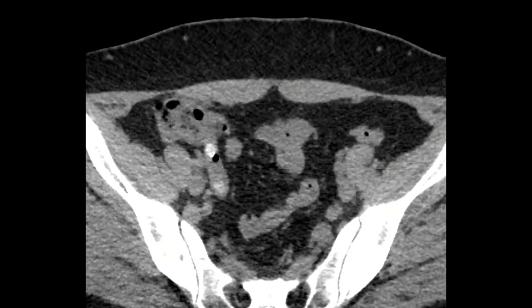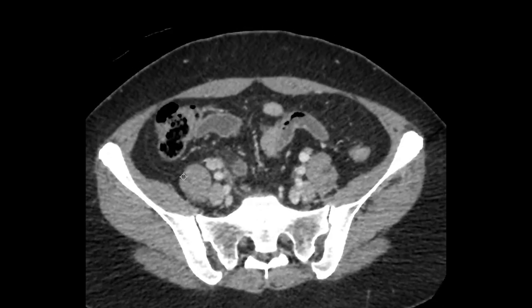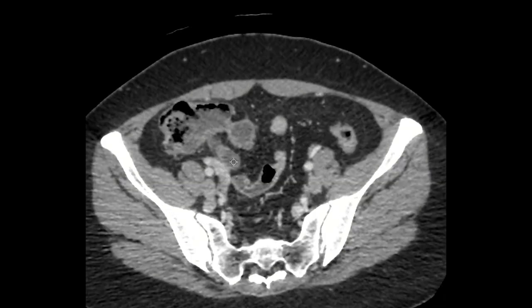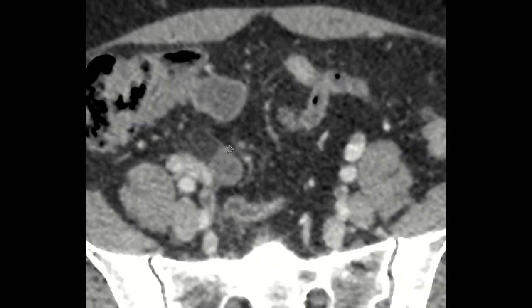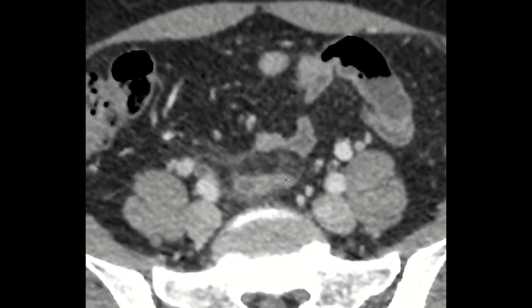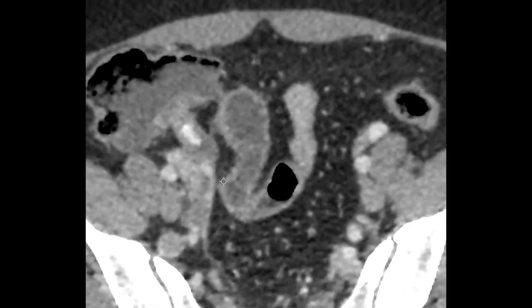And so this patient ended up presenting several months later with right lower quadrant pain. And when we scroll down in this particular CT scan, we can see here's our appendicolith, and here the appendix looks a lot more dilated. And now there's some inflammatory changes you can see surrounding the appendix here, and more distally as well. And so this patient ended up having appendicitis.